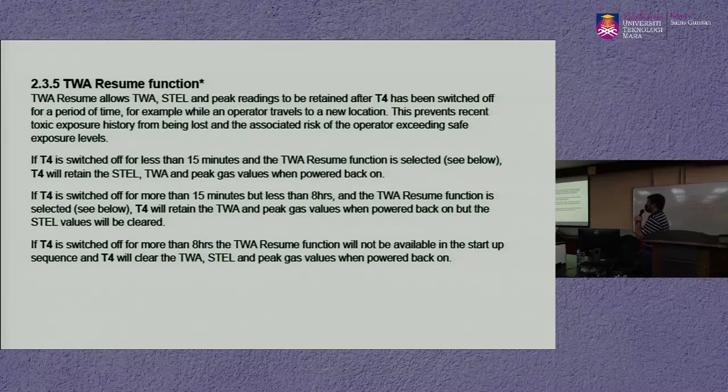If T4 is switched off for less than 15 minutes and the TWA resume function is selected, T4 will retain STL, TWA and peak gas values when powered back on. If T4 is switched off for more than 15 minutes but less than 8 hours, the TWA resume function is selected.